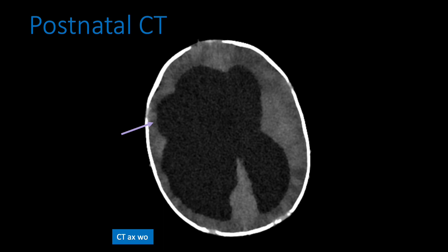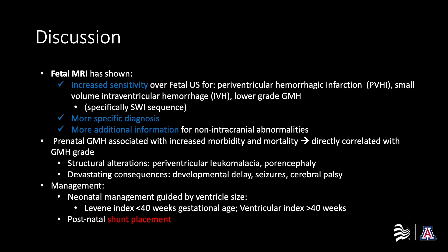Axial non-contrast CT head obtained a few months after birth demonstrates evolution of intraparenchymal hemorrhage and germinal matrix hemorrhage. There is significant worsening of ventriculomegaly with progression of porencephalic changes to encephalomalacia.